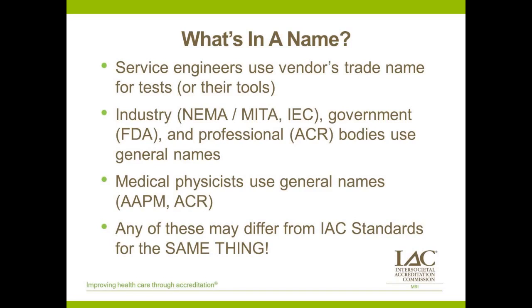When you look at bodies that are not manufacturer specific, so there are industry groups where the MRI manufacturers all put their heads together and come up with industry-wide standards for how they're going to report different performance and safety issues. Groups like NEMA or MITA within the United States, groups like IEC internationally, they have standardized names. So within an IEC document or within a NEMA document, they'll say, okay, we're all going to agree on a common definition of what signal-to-noise ratio is, and we're all going to call it that. That doesn't mean that every individual manufacturer will then use that same name when they develop tools for doing those assessments on their own equipment.